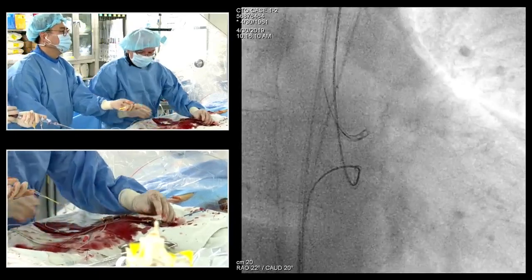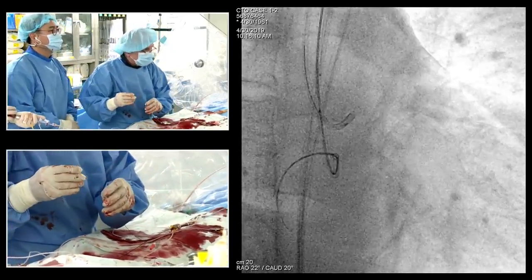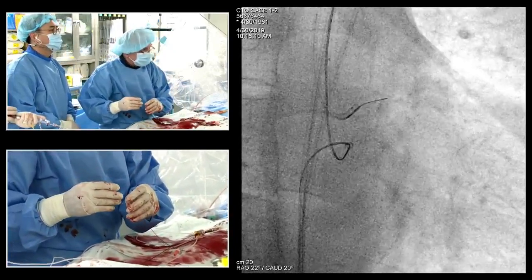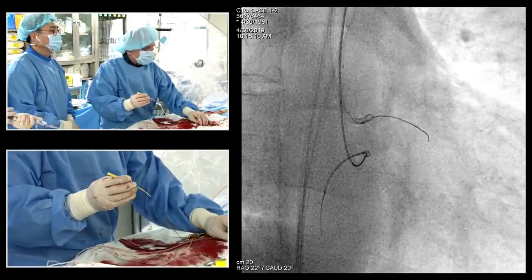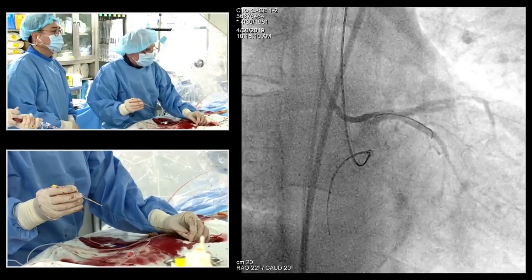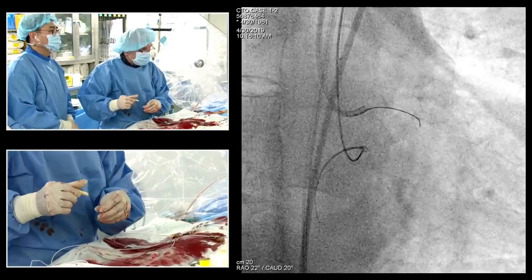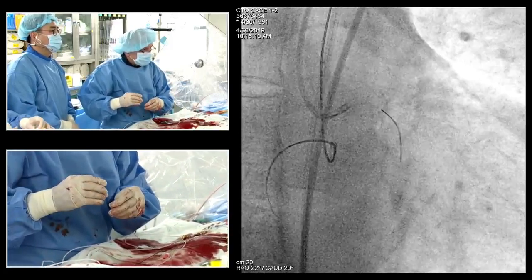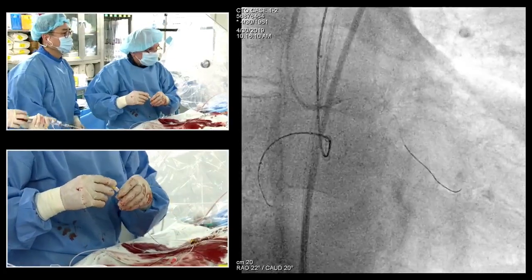Coming. Advance the wire before the Caravel. Yeah. It's always advisable. So let's explore the septals. If we go there, where, inject test two. Okay, come on. It wants to guide us towards this first PL. Okay, I always follow my wire. Okay, check.